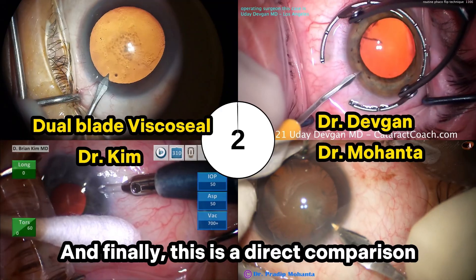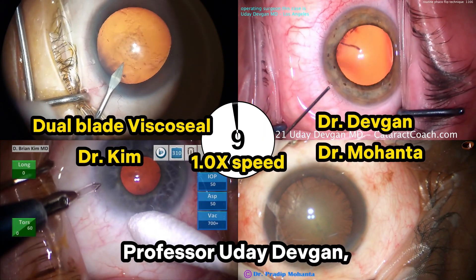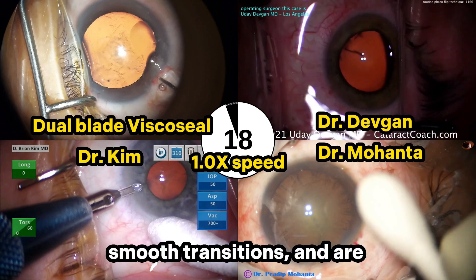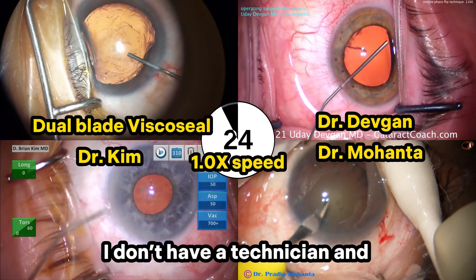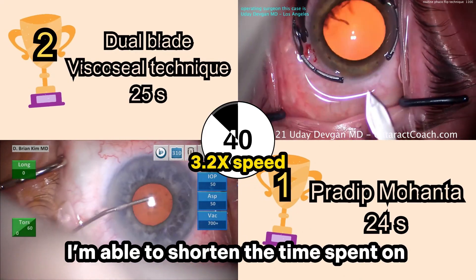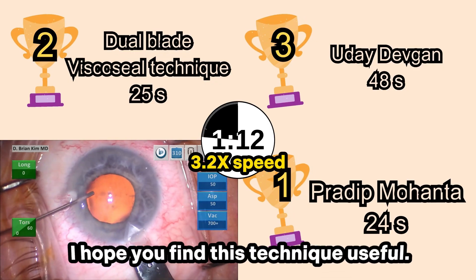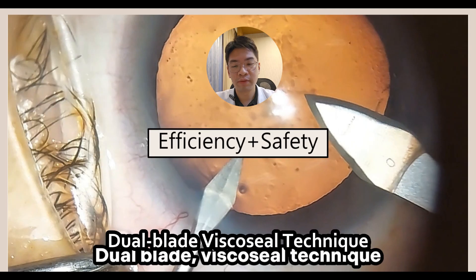This is a direct comparison of the speed of my dual blade Viscoseal technique with YouTube cataract mentors like Professor Uday Devgan, Dr. Brian Kim, and Dr. Pradip Mohanta. They are very experienced and renowned surgeons with very steady hands, smooth transitions, and highly synchronized with their scrub technicians. I don't have a technician and I'm a relatively young surgeon, but with this dual blade Viscoseal technique, I'm able to shorten the time spent on these steps without sacrificing safety and without relearning anything. You're simply changing the sequence of surgical steps that you have been taught during your surgical training. I hope you find this technique useful.